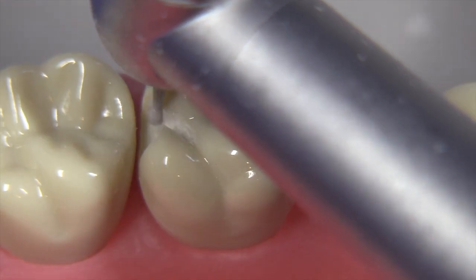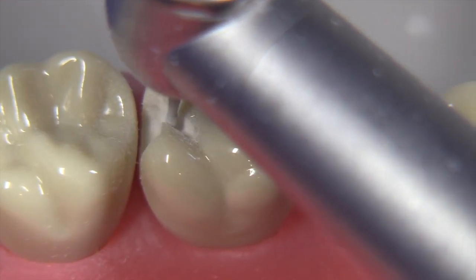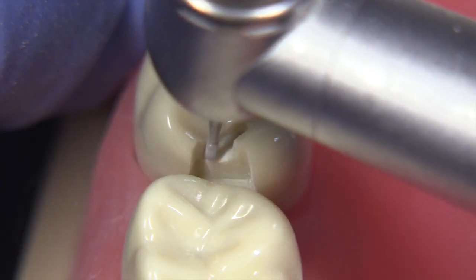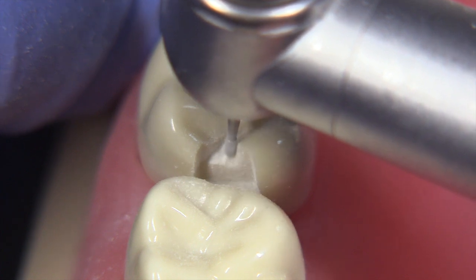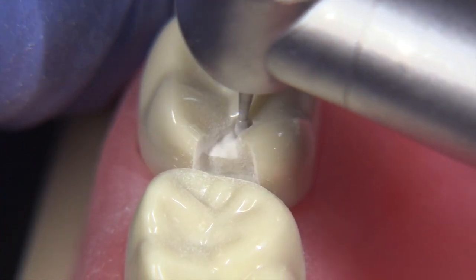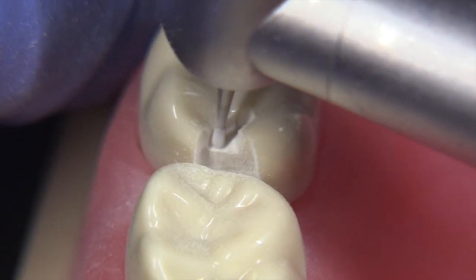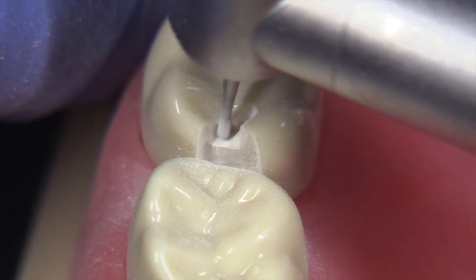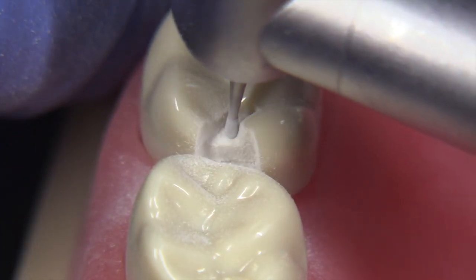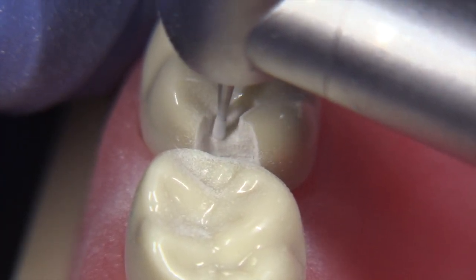Now it's just a matter of smoothing off the sharp transitions from the occlusal to the box, which is the S-curve management. This is a good view to show how we focus on those corners right there, where you have a little bit of excess tooth structure - that's an important thing to address while you're refining your S-curve areas.